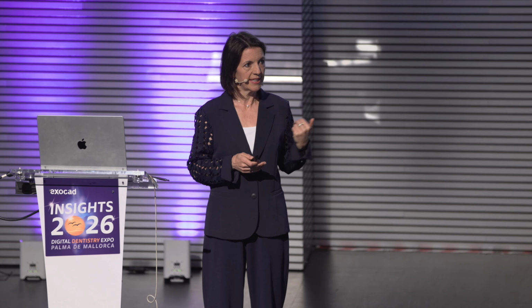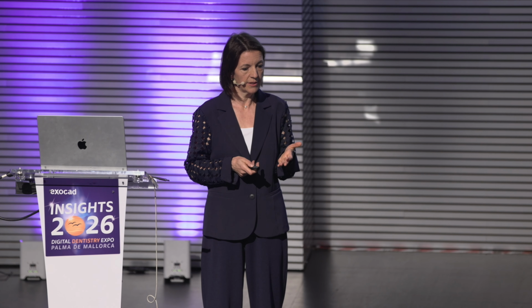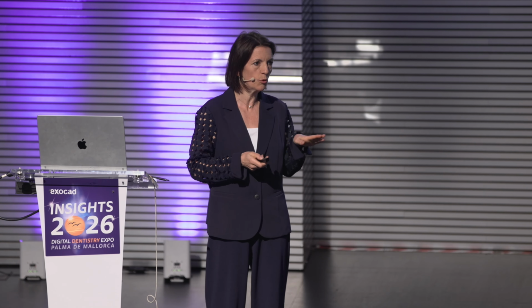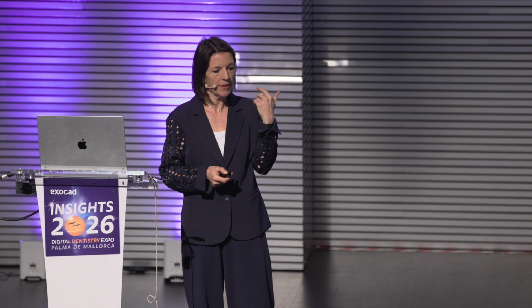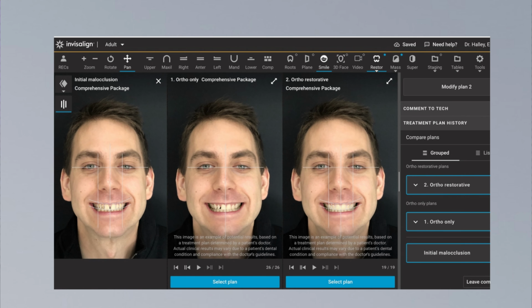And being able to put cases into Smile Architect direct from the intraoral scanner and play around with spaces. If there's spaces between teeth, what if we close the spaces? What if we leave some space open? Do we need to restore teeth? Could I achieve this with restoration alone? All of this trial and error helps us build up our thinking process before we've taken it to the patient, before we've engaged the patient in the process of what it would take.